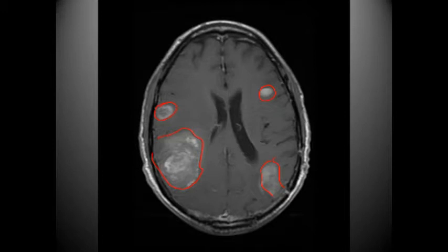So in this image, we see that we have the lateral ventricle with the septum pellucidum residing in between, and we have what almost looks to be a lack of symmetry on the right ventricle pushing over towards the left. We see that we have compression of the occipital horn and possibly slight midline shift. It's not as great as there could possibly be, but there does appear to be midline shift.